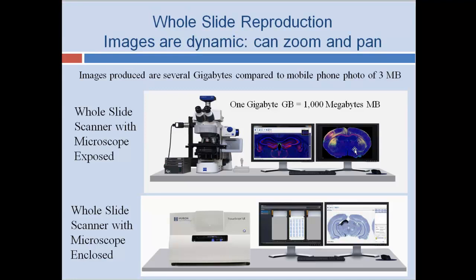And you see on this top image here, this microscope has a motorized stage. And when it's all set to go, with the computer software, you start at a certain place, and then that motorized stage will advance frame by frame or tile by tile with the computer operating it and taking a photograph at each point.